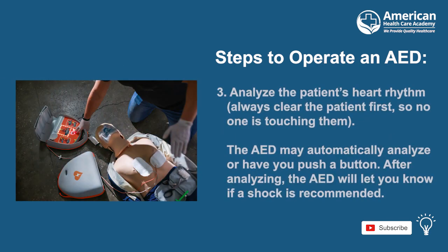Step 3. Now you will analyze the patient's heart rhythm. Ensure that no one is touching the patient, as this can produce a false reading or injury. The AED device may automatically analyze the patient's rhythm, or it will prompt you to push a button so it can start reading the rhythm. After analyzing, the AED will let you know if a shock is recommended.